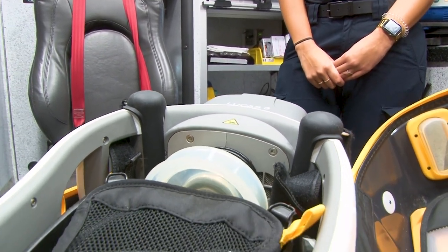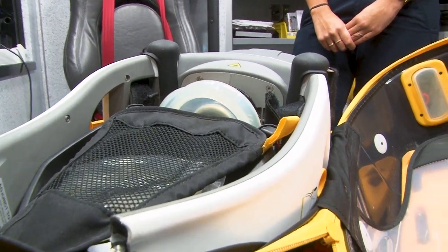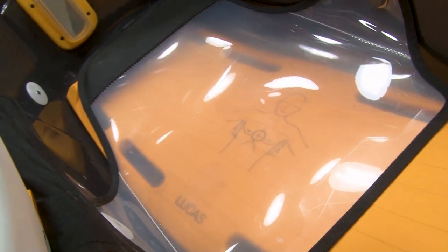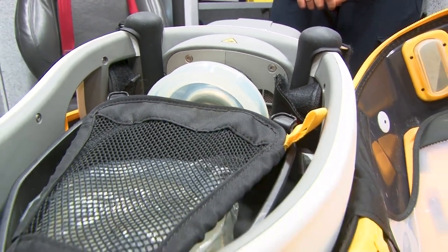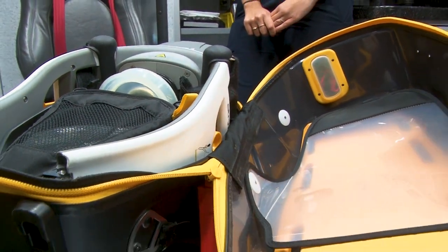So why is that important? Outside of the EMTs and the paramedics who work on this truck, this is probably one of the most important pieces of equipment. We all know that CPR is what's proven to save lives. The data has not come back yet on any of the medicine that we have that this works or doesn't work. The one thing we know for sure is that compressing the heart when it needs help to be compressed and to get that blood flow going again, to perfuse the organs, that this machine does it.